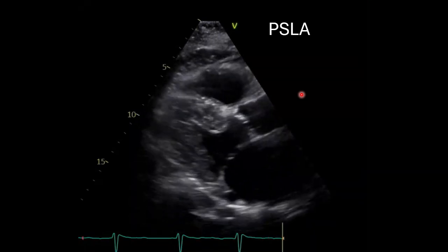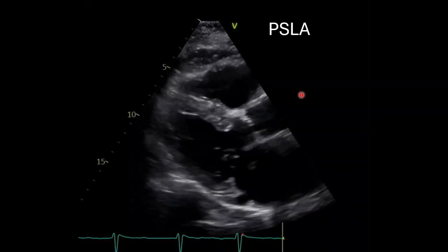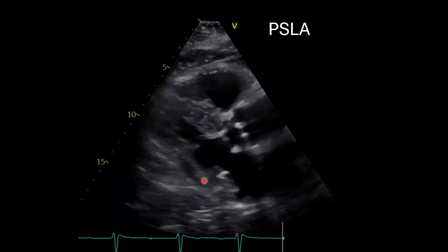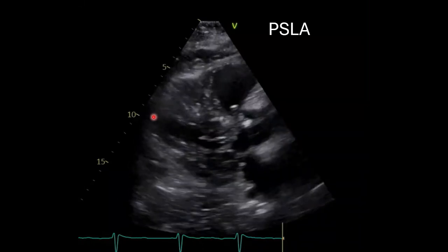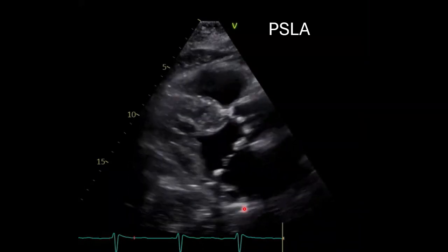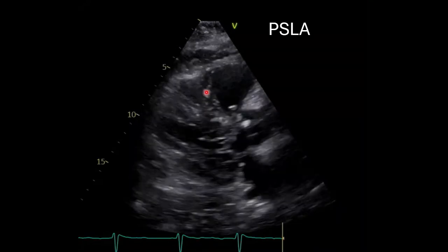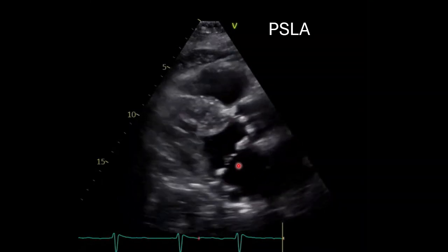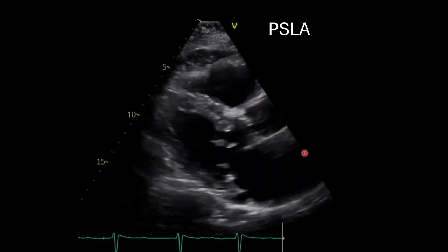We'll start our cardiac exam in the parasternal long axis view. Notice that the patient has a normal left ventricular ejection fraction. There's no pericardial effusion, and his right ventricle isn't enlarged. However, there is a suggestion of some left atrial enlargement here.